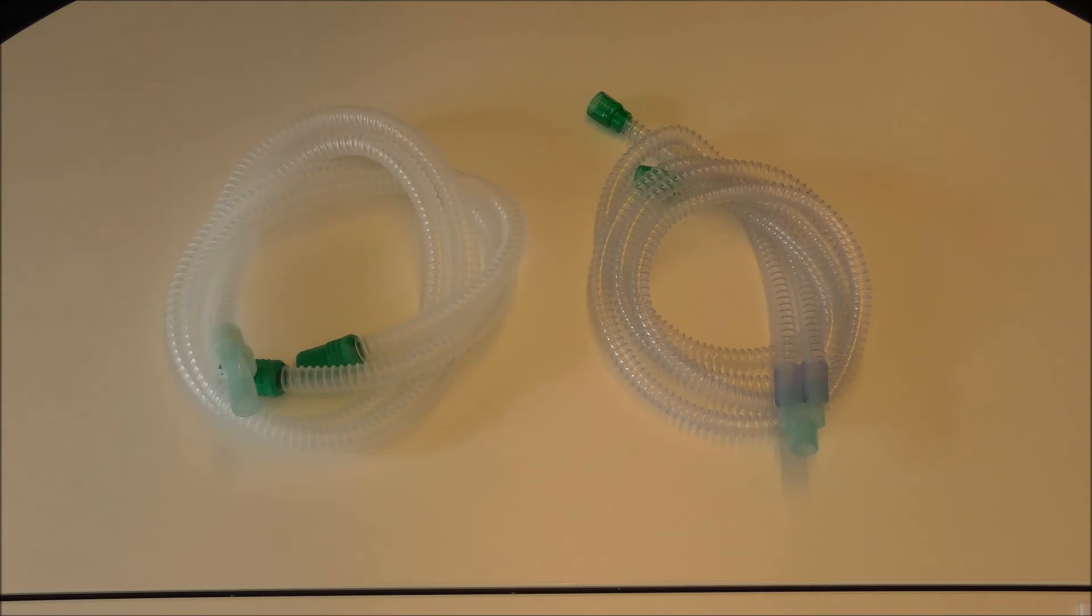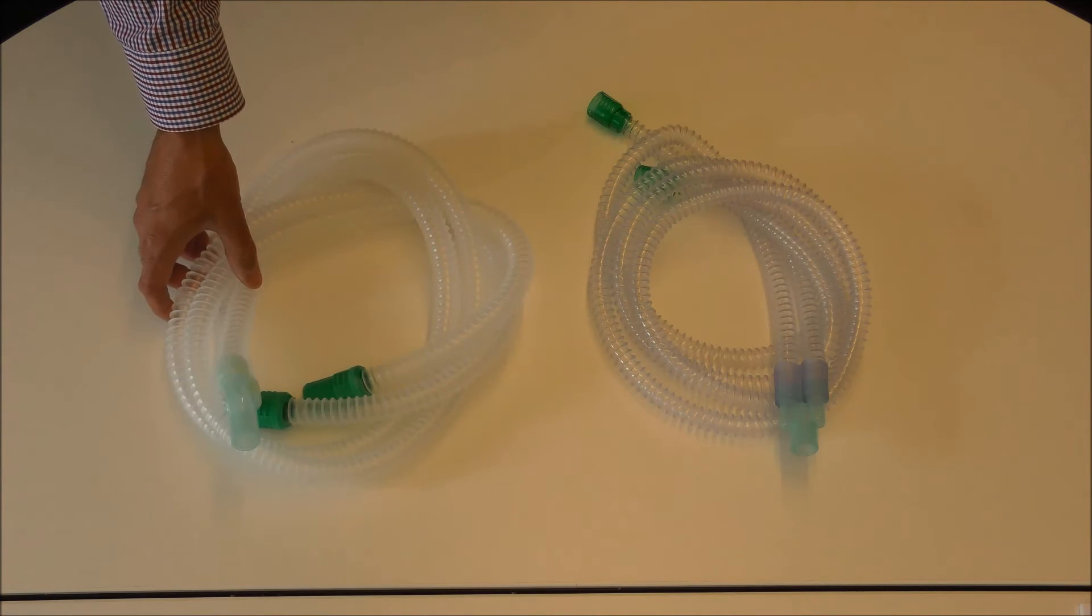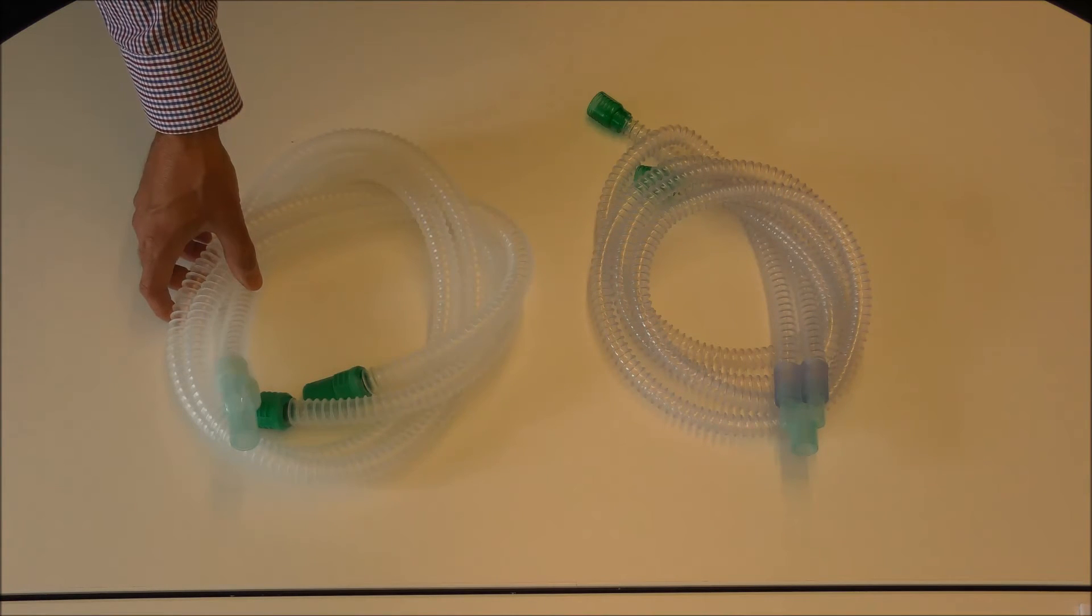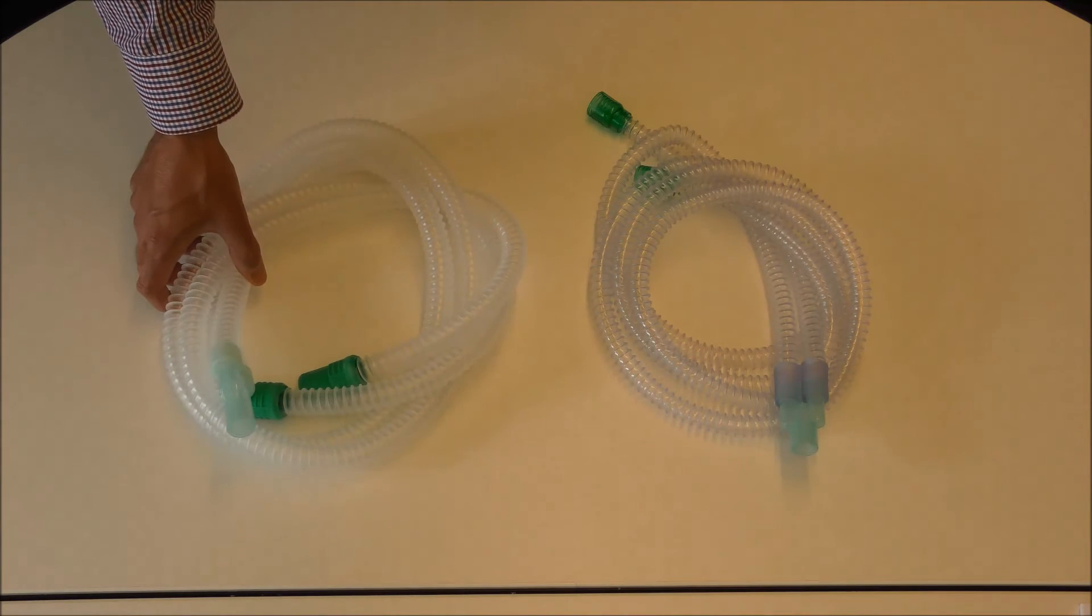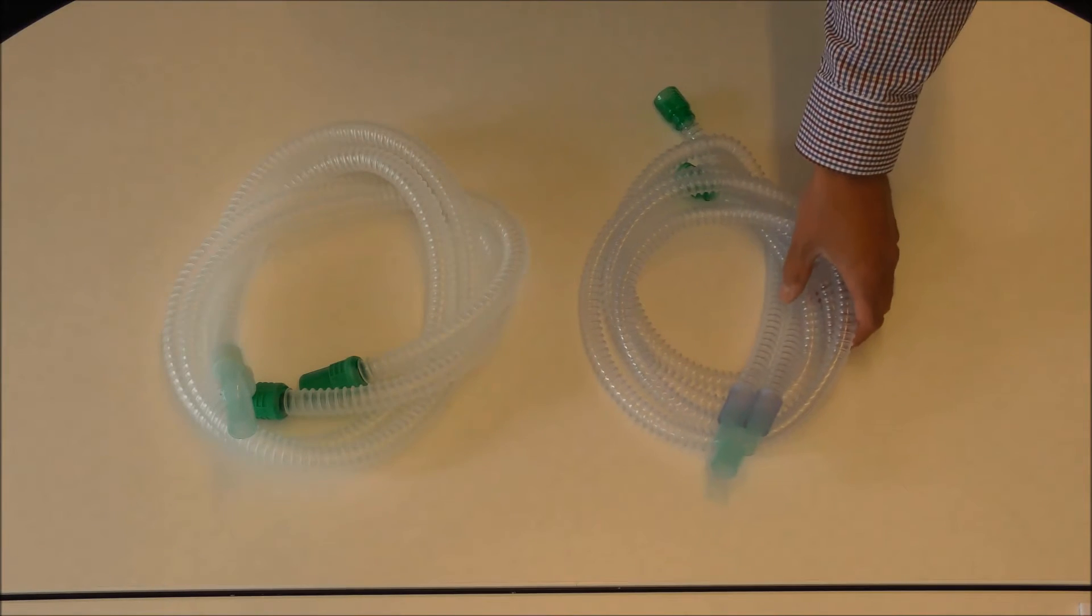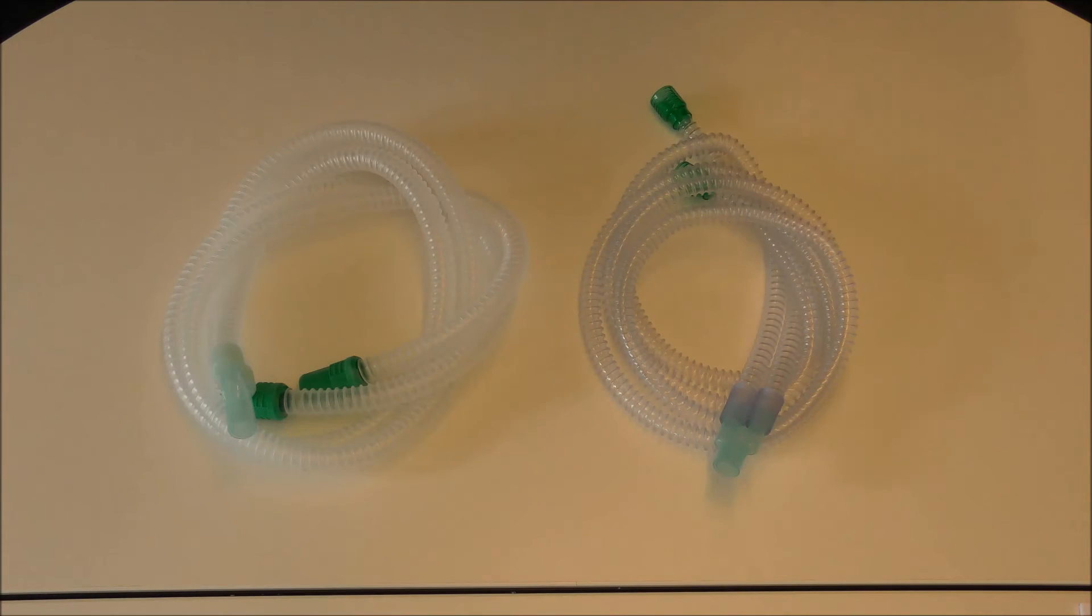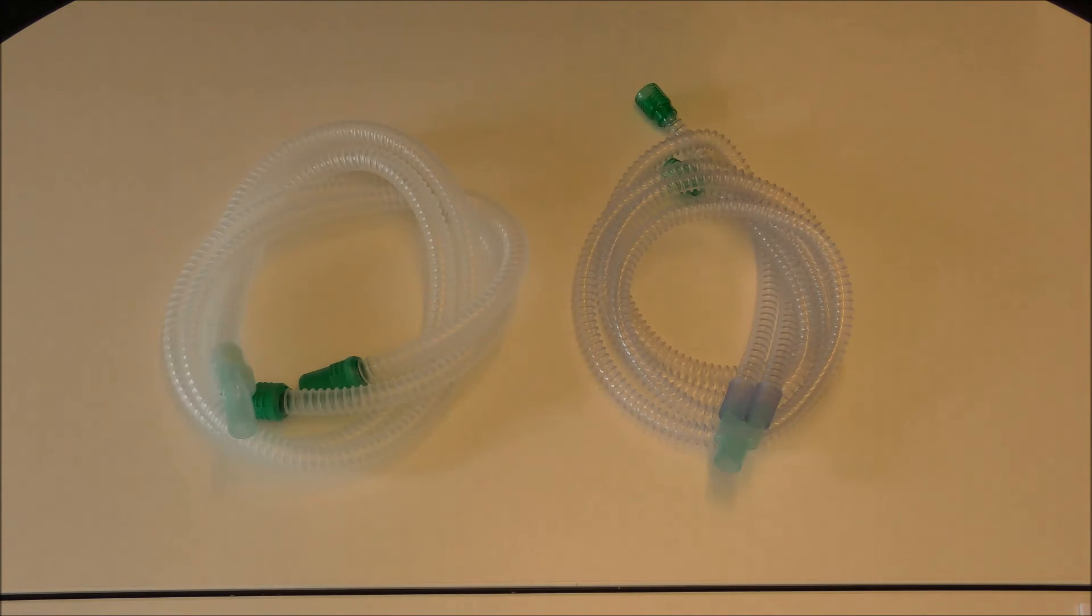These are the dual limb circuits for use with the Vivo60 ventilator. The adult circuit with the 22mm diameter with the part number 005520 and the pediatric version with part number 005519, the 15mm circuit. Both circuits are disposable.